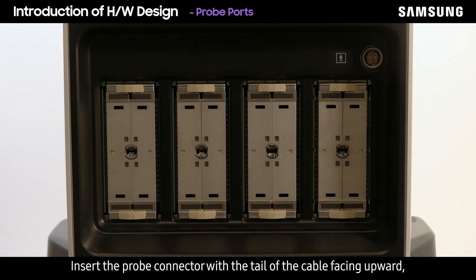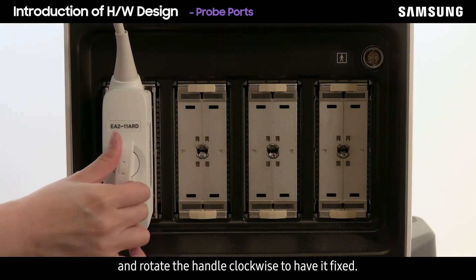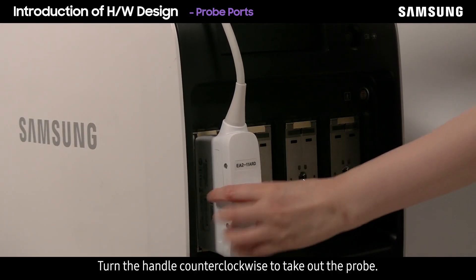Insert the probe connector with the tail of the cable facing upward and rotate the handle clockwise to have it fixed. Turn the handle counterclockwise to take out the probe.